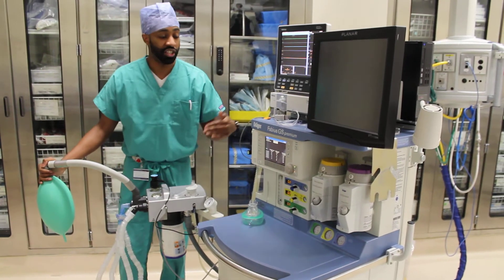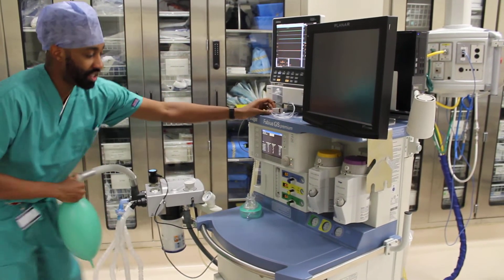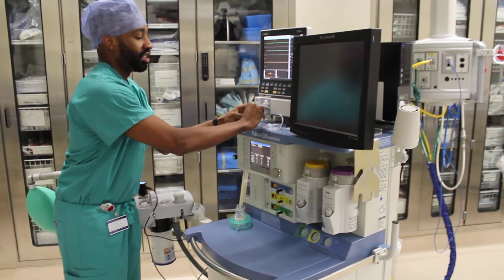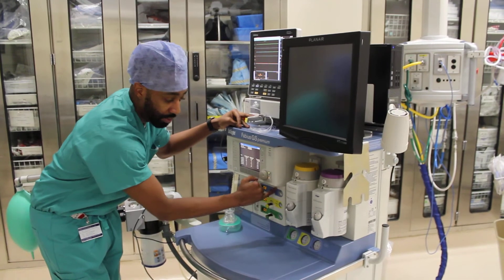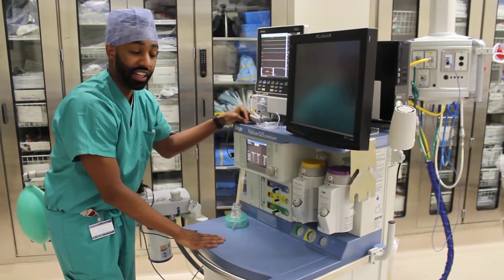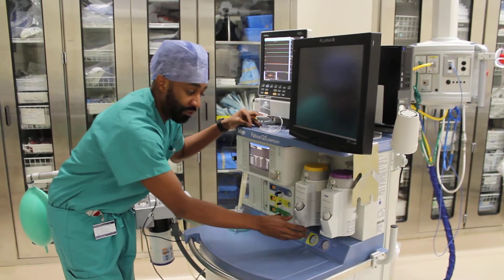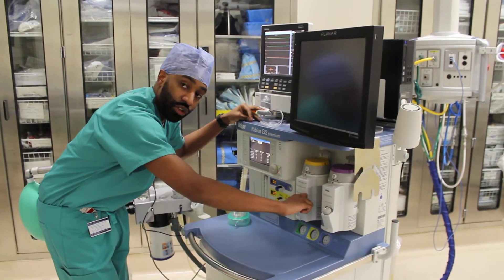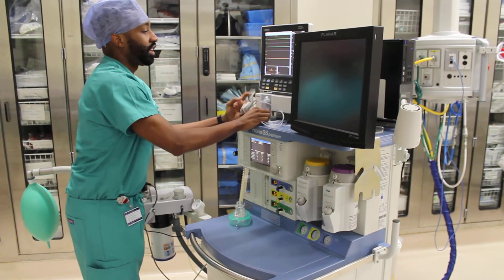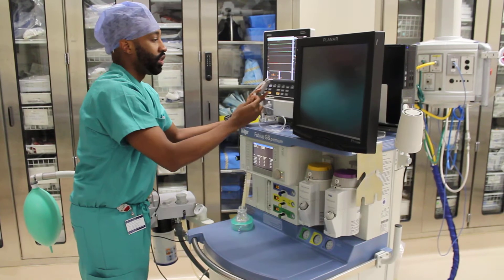That is enough to start the machine to run through its entire leak and compliance test. At this point this is a great time to check everything else — your monitors, your cylinder pressures here, and your pipeline pressures here — to make sure they are at the appropriate values. We can look into our anesthesia agent to make sure it is full, intact, secure, and that our refill knob is closed all the way down. We can look at our monitor and see that we have our pulse ox reading coming up as well as our CO2.